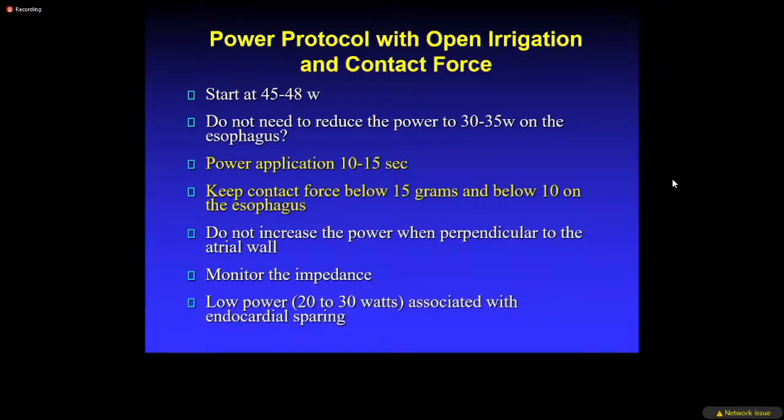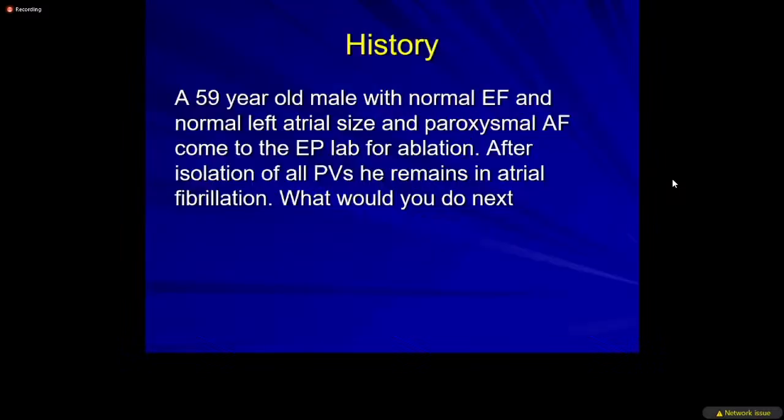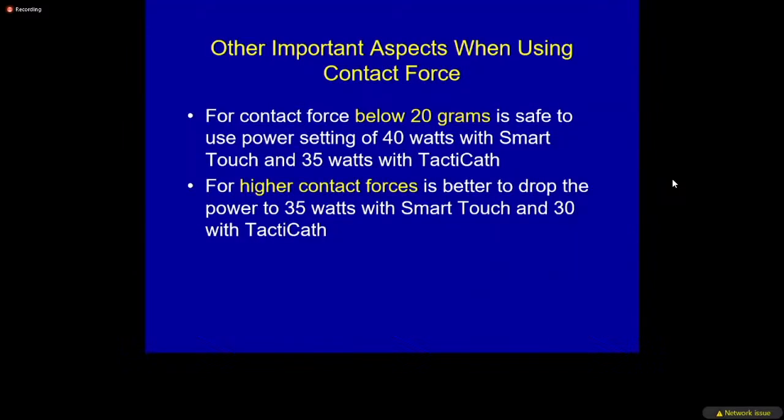In our lab, we call power setting of 35 or lower the sham procedure. So this is to give you an idea. And then this is to make the point that we really don't require high contact force. Actually, if you go to high contact force, you really need to reset your power, because you increase the chance of steam pop if you are around 45 or 50 watts. So you have to be careful.